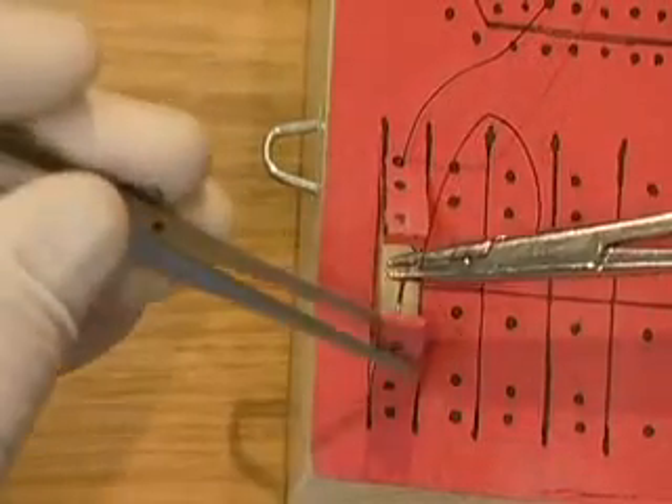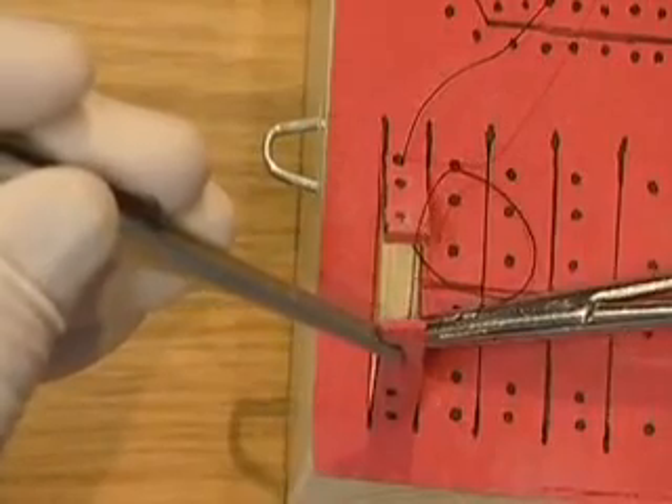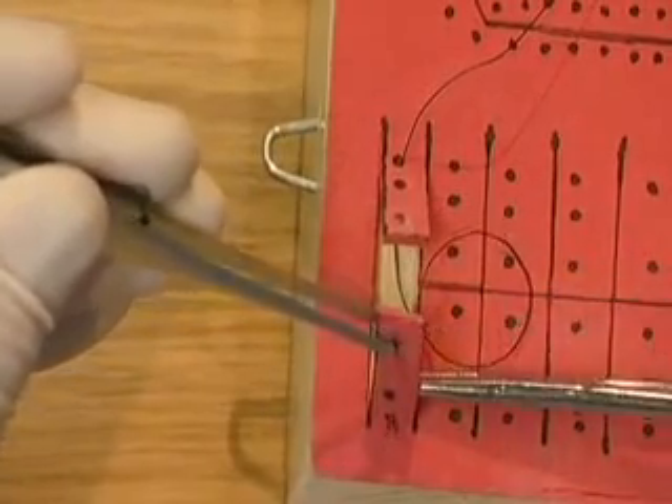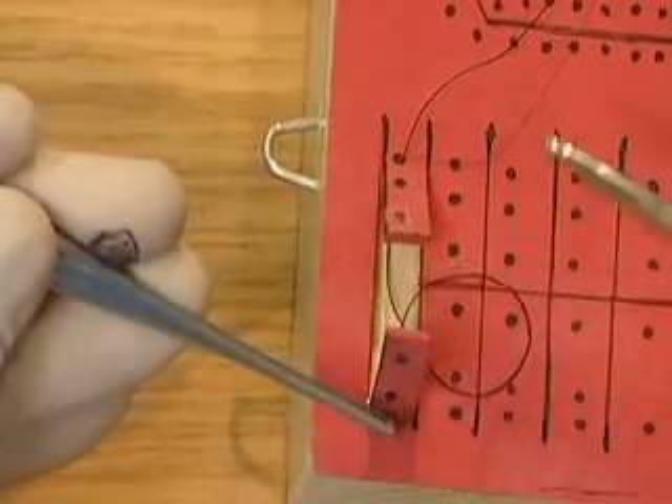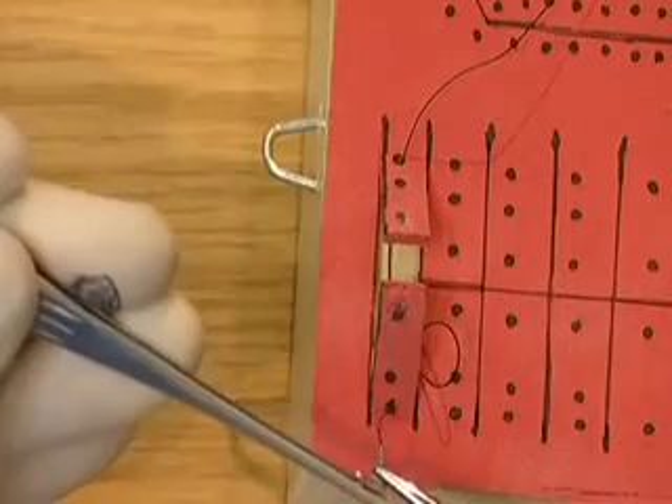Pick up the flap with the tissue pickups. Insert the needle through the furthest hole. Pick up the needle with the tissue pickups and pass the needle to the needle holders. Pull the suture through.